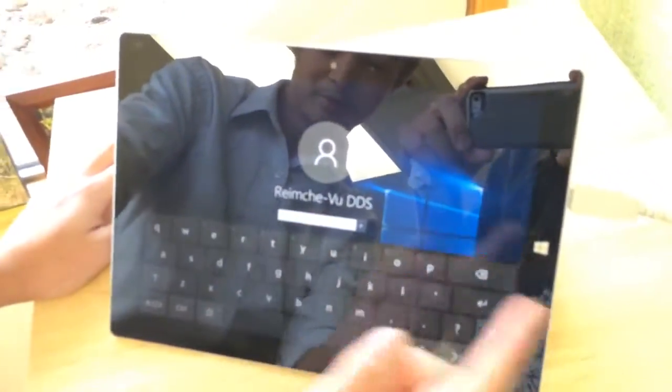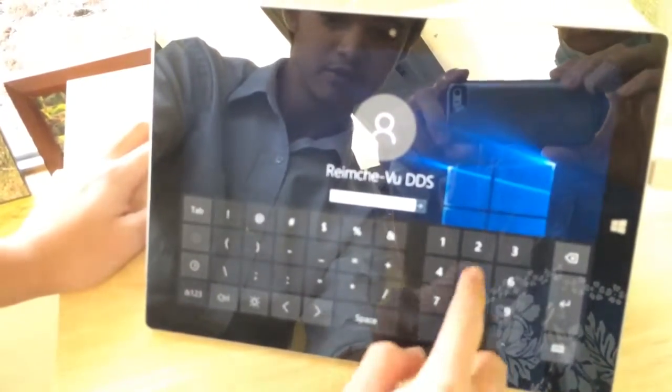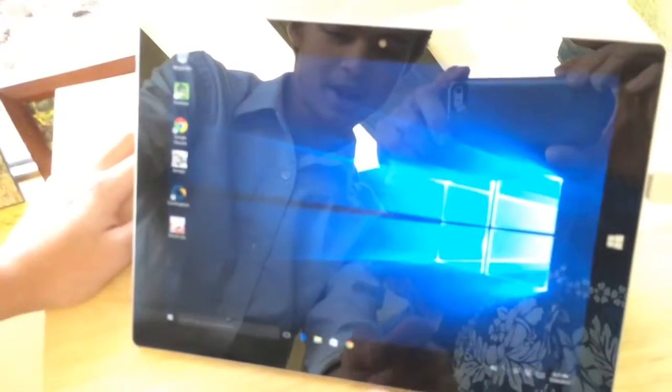Push the power button right up on here, and then we just slide up like this. The password is going to be scurve, SCURVE, and then 0525. You're going to log in like that. Now, what you'll see is this icon right here, and this is the icon you're going to push to open the program. You're going to hit it, just like that. It's going to pop up.